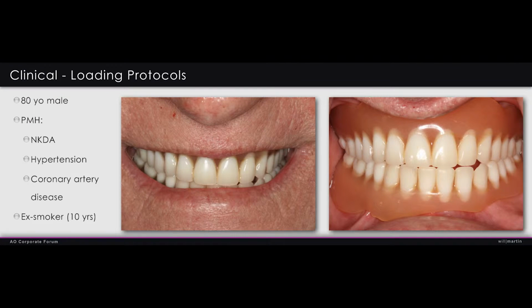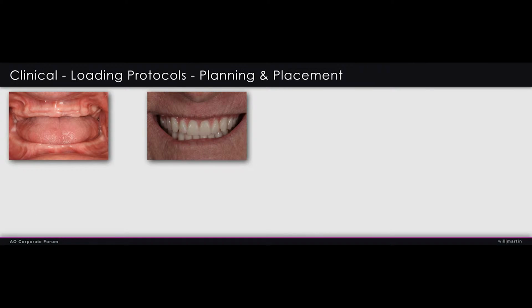Here's a more advanced case. This is a patient that has some health risk factors, would like to try to consolidate the treatment into a single stage treatment. He is unhappy with his dentures. They're really unstable, so he's looking for some more of a stabilized fit.